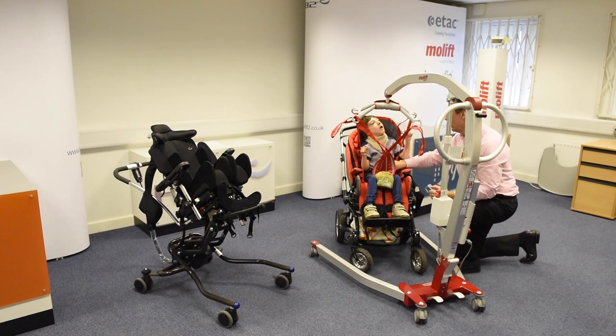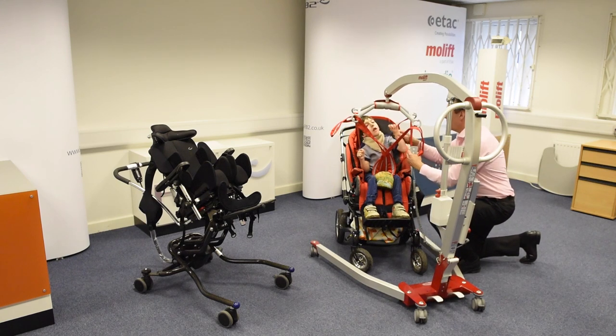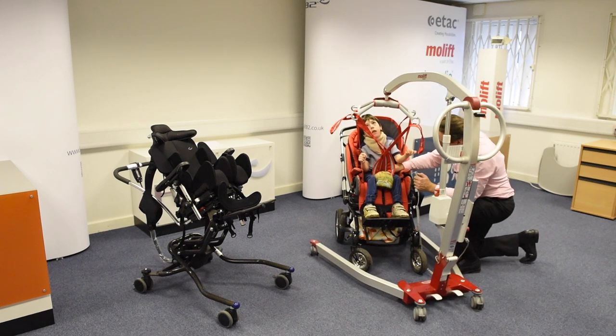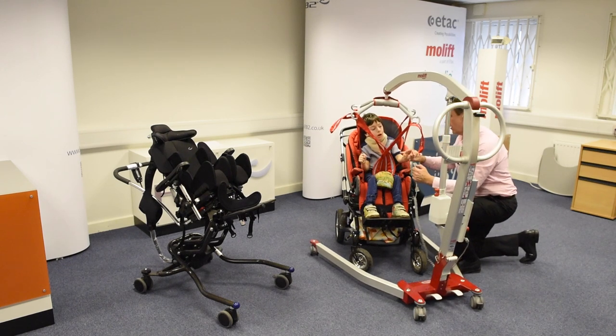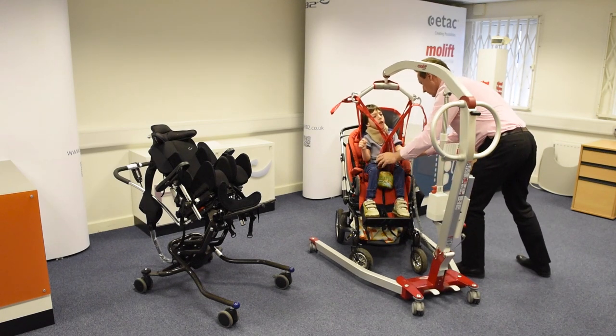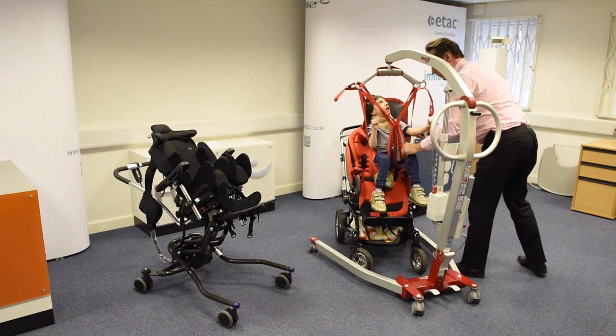So I'm just going to take the tension, and then once we've got you up slightly, I can release the belt on your tummy. Here we go. Up in the air.